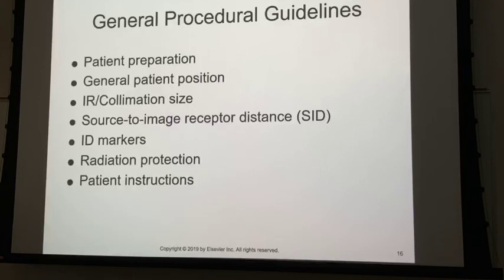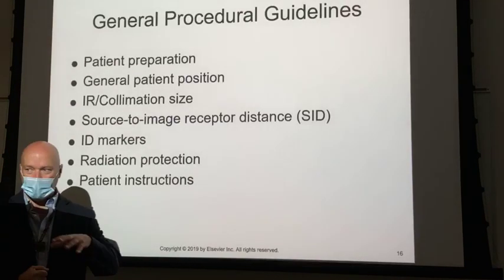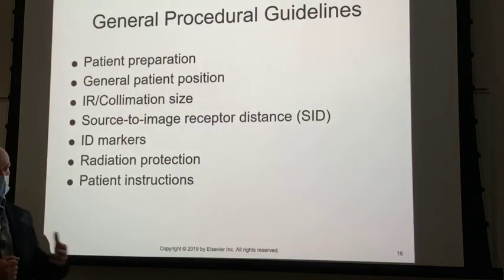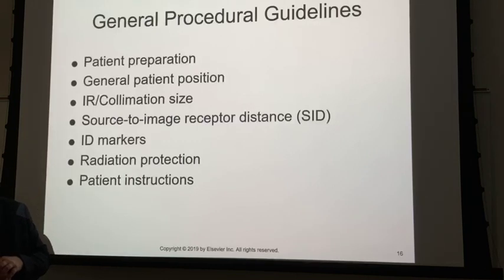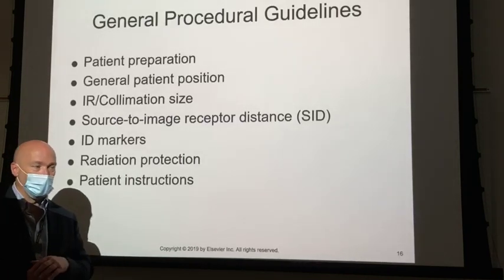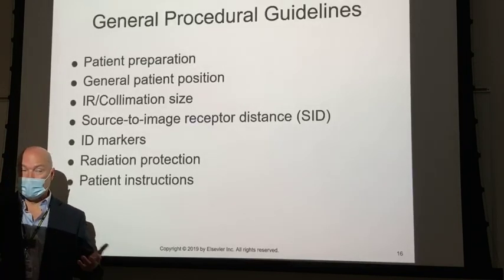Hopefully that doesn't occur. So anyway, whenever you have a patient for any kind of exam, you're going to need to remove whatever artifacts you can from the patient. Sometimes you're not going to be able to. Casting material you can't take off. If the patient has any kind of splints, it's not your job to remove splint material, because if you do and it causes greater problems with the patient, compromises blood flow or whatever, then you're personally and professionally liable.